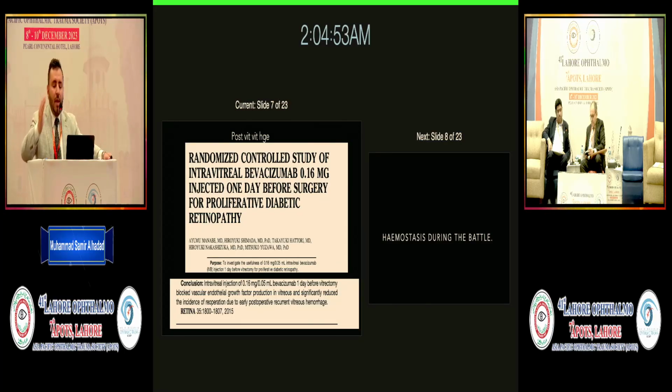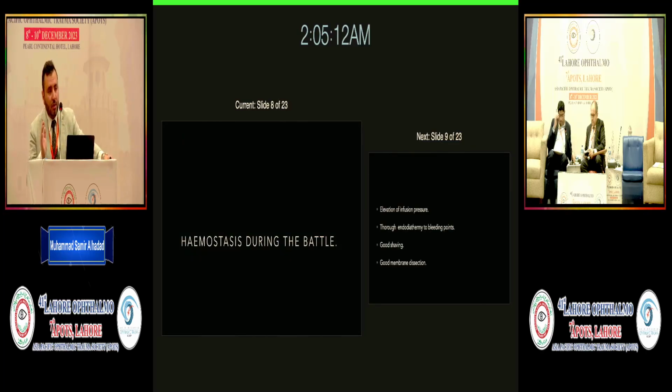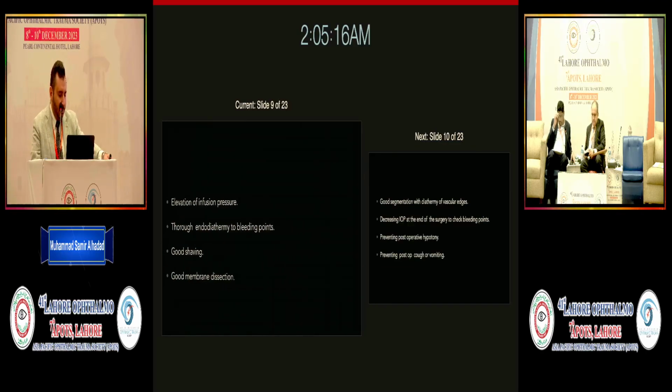So we came to the conclusion that doing a proper PRP before the surgery, and injection of bevacizumab or any other anti-VEGF 24 to 48 hours before the surgery, decreased the incidence of recurrent post-vitrectomy vitreous hemorrhage. Okay, this is before the diabetic vitrectomy. What about the hemostasis during the surgery?